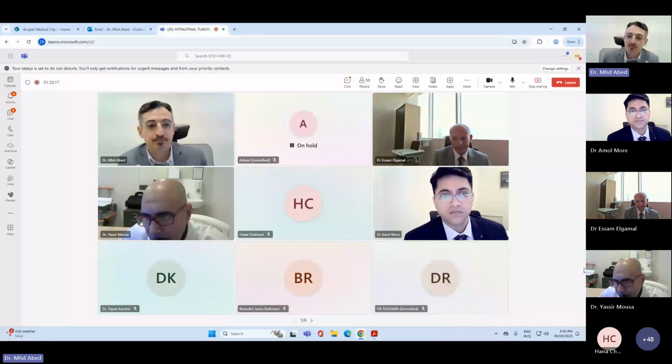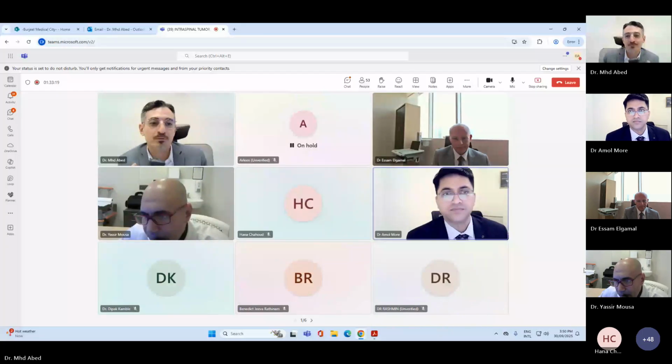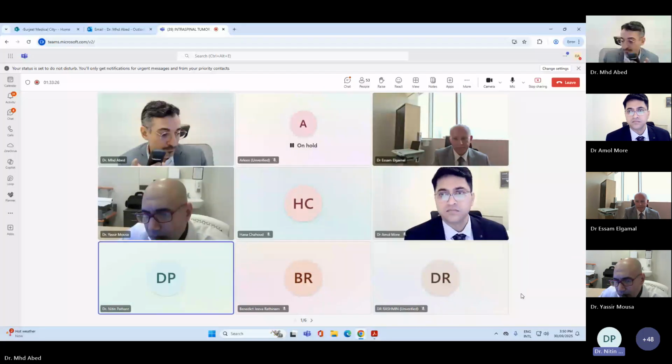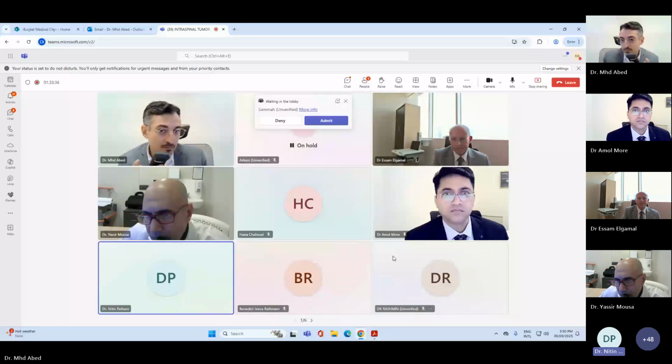Thank you. Dr. Adil, I just wanted to ask one more question. Commonly we see syrinx in the cord as an incidental finding. Do you feel there is a need for contrast, just to rule out any underlying enhancing nodule in the lesion? There is always a suspicion. Do you recommend doing a contrast for this kind of incidental finding?